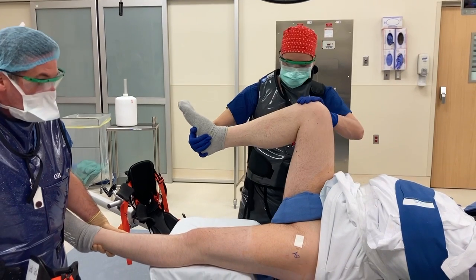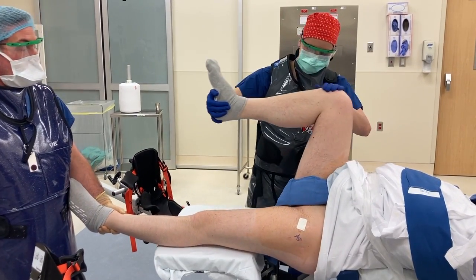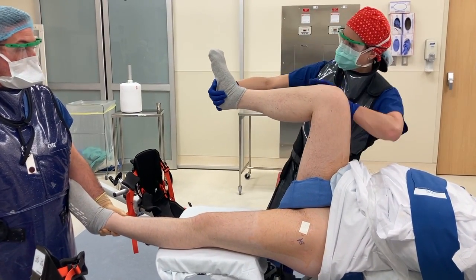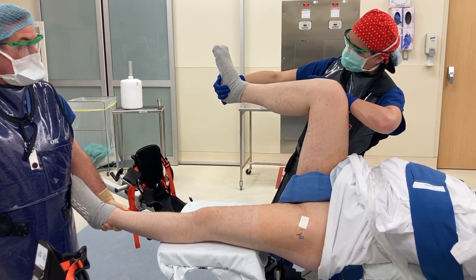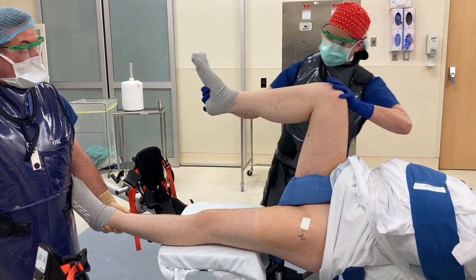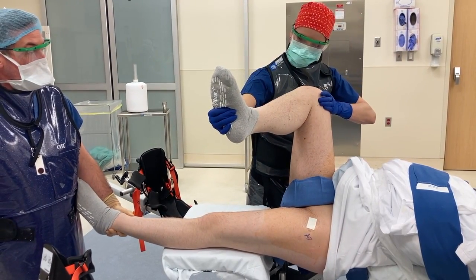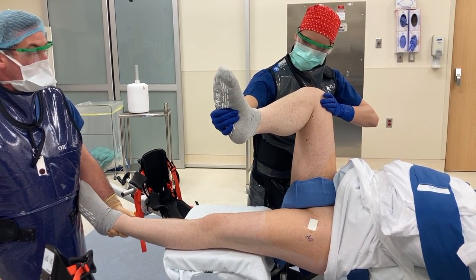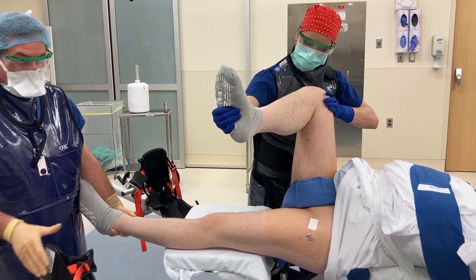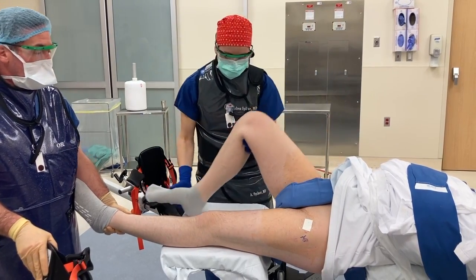We begin with a pre-procedure assessment of motion. With the patient supine, we check hip flexion, and with the hip flexed to 90 degrees, we check hip internal rotation, external rotation, and a combination of abduction and external rotation in the butterfly position.